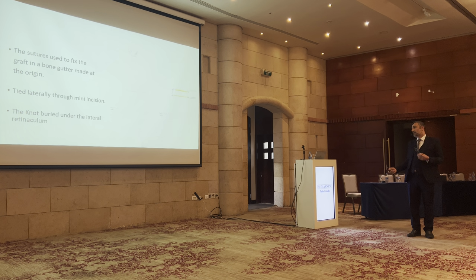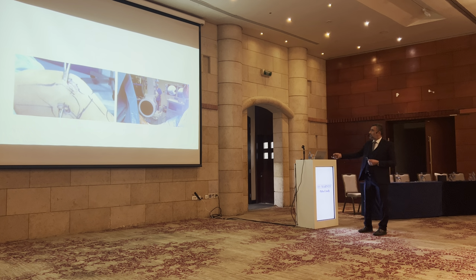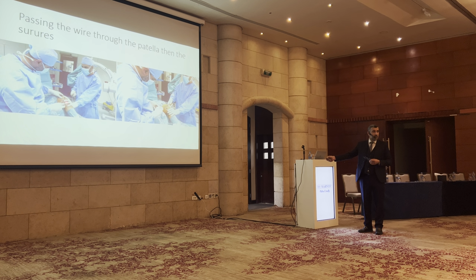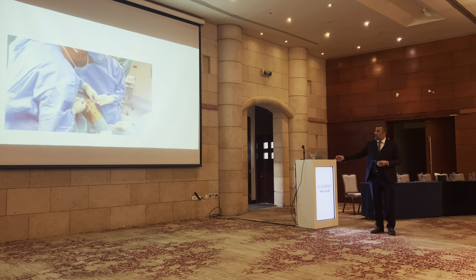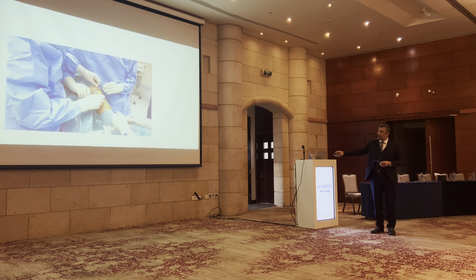This is the graft, and this is the suture. It's not clear here, unfortunately. But I can show you here inside the operation the same technique. You find the portal and the tunnel. And here, passing the wire through the patella. You see, we pass the wire with a suture inside the patella, and we pass another suture like the position of the anchor. And after that, we test how stable is the graft.